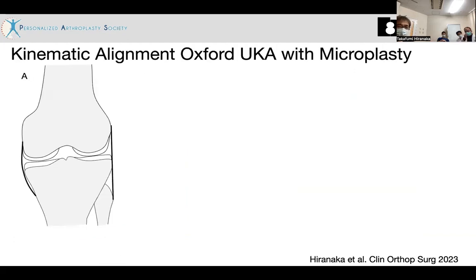So I devised a new technique. The key point is the spoon. In most patients, the medial joint line and the medial tibial plateau are parallel to each other.